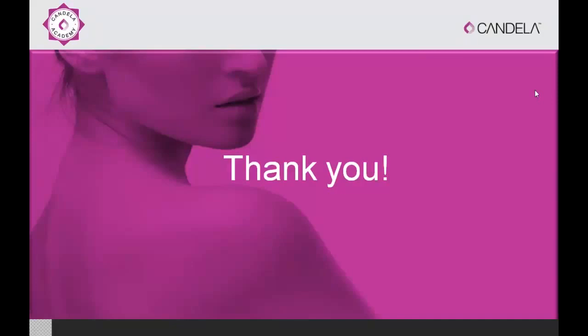Combination treatments. Yes, combination treatments, of course. Remember, the PicoWay does not necessarily need to be used on its own. So with melasma, for sure, you can combine it with topical treatments and/or with tranexamic acid injections afterwards. In some patients, I would combine that, and there is no concern. I would treat with the PicoWay, and then inject the tranexamic acid afterwards, or you can combine with topical treatment. So combination with melasma is not a problem.